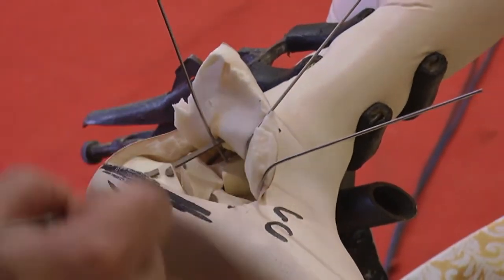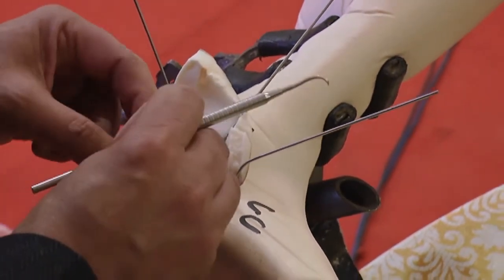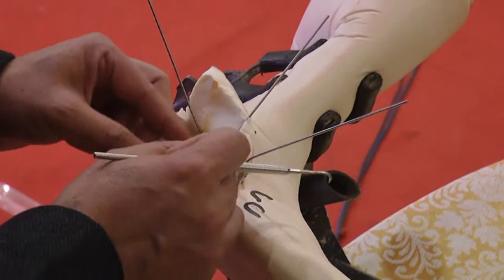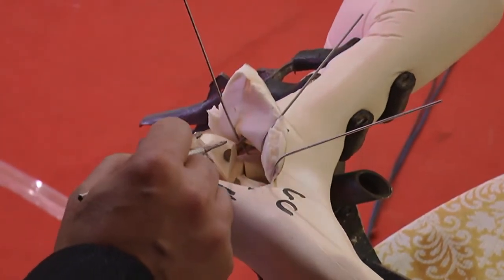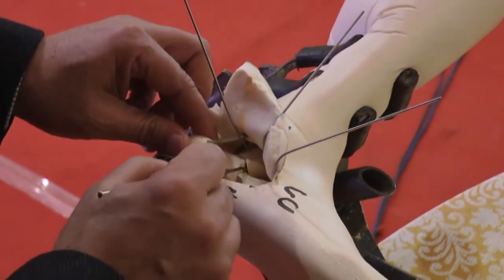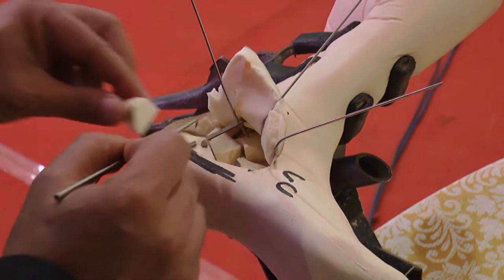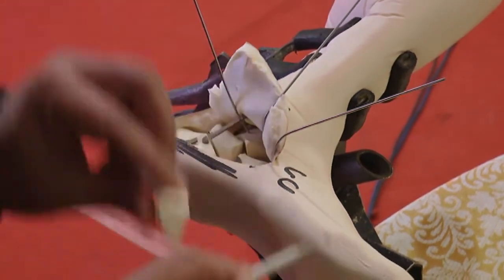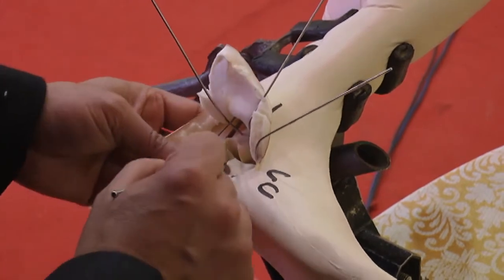Pradeep will come. So what we did was the lateral wall blowout was here. I'm sorry. So the lateral wall blowout is on the top, like this, which is obstructing your view to the facet there. So the lateral wall has to be taken out, and then you will be able to see the fracture line there.